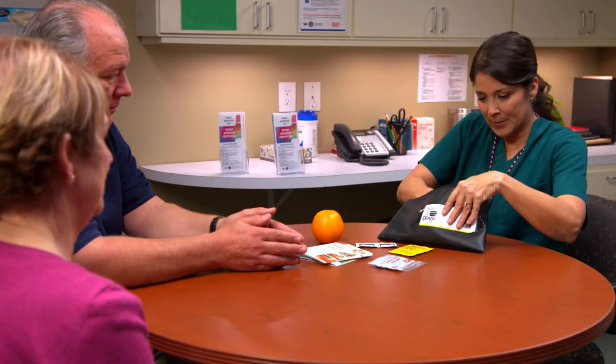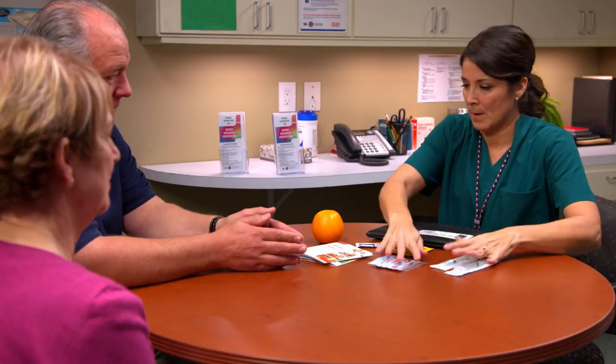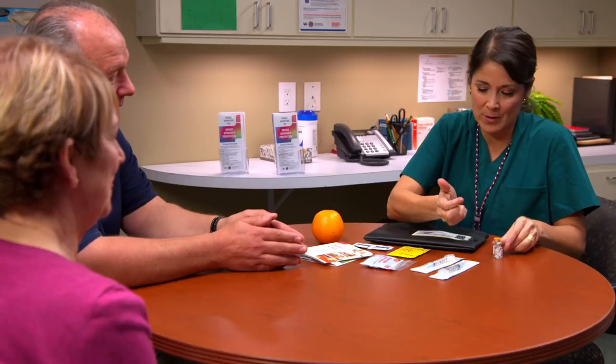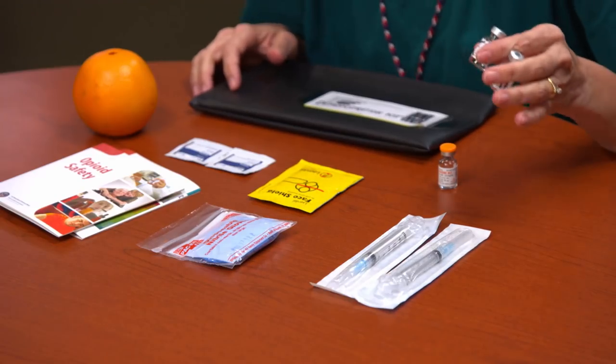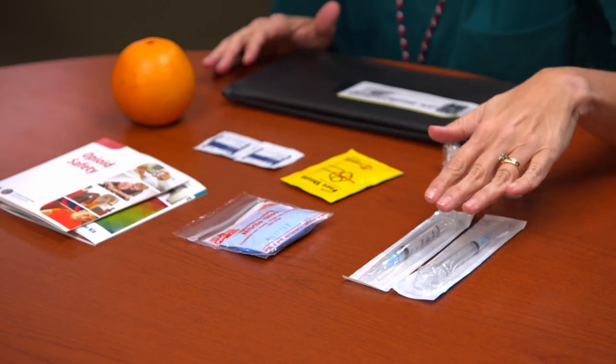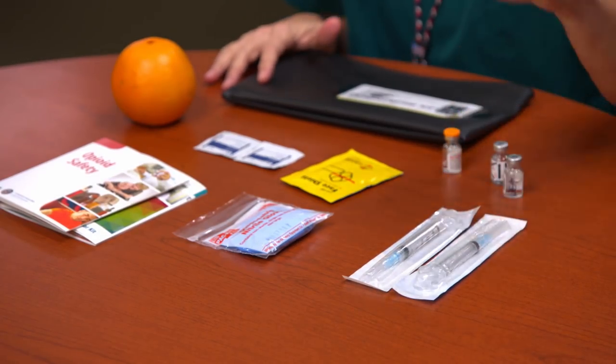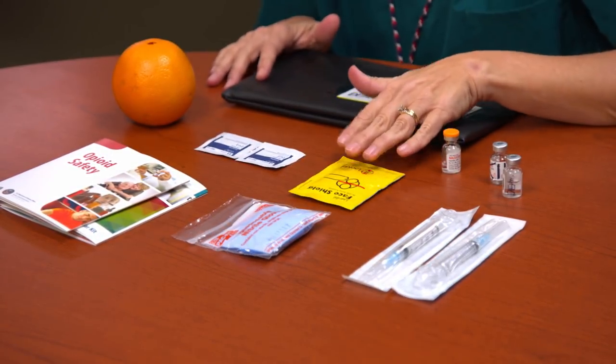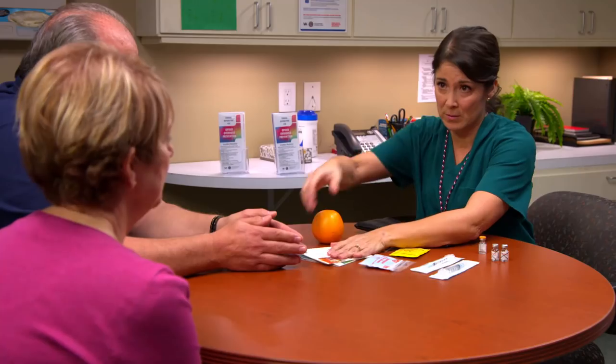Let me get all of this out. I know it's going to seem like a lot, but it will make sense in a second. Alright, let's go ahead and start with the naloxone vials. Normally they'd be sealed and capped, and this is what the real one looks like. We also have two packaged hypodermic needles, two alcohol swabs, rubber gloves, a face shield, and two brochures. So Alice, you've dealt with needles before, so why don't you open up the brochure and look at the instructions on how to give the naloxone, and then we can try it out with these sample vials.